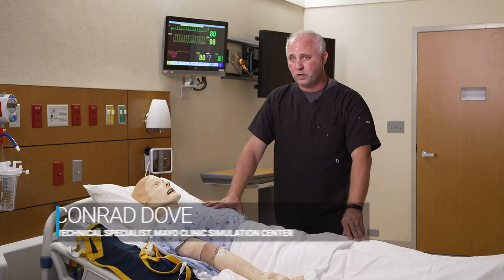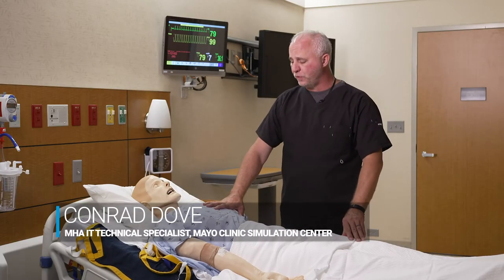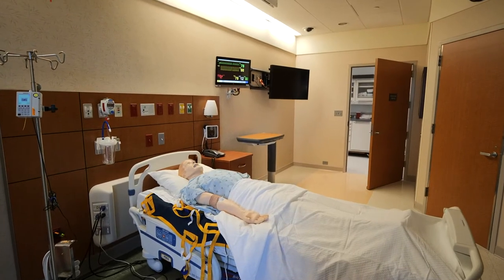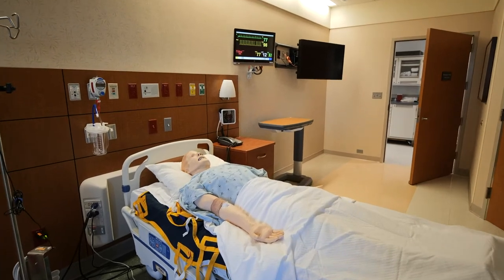The SimMan 3G is not the only mannequin on the market, but he is probably the most versatile. He can do anything but get off the bed and walk away. He cries, he bleeds, he sweats, he pees, he has heart sounds, bowel sounds, and chest sounds.